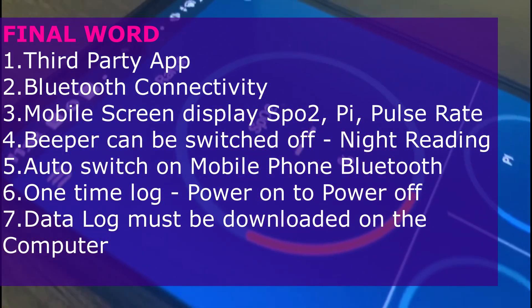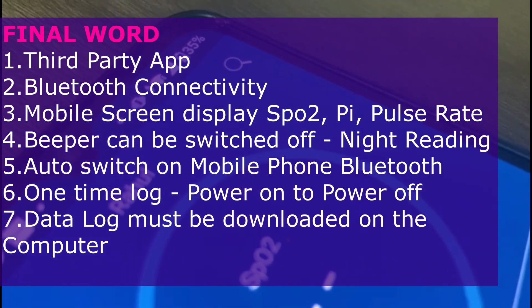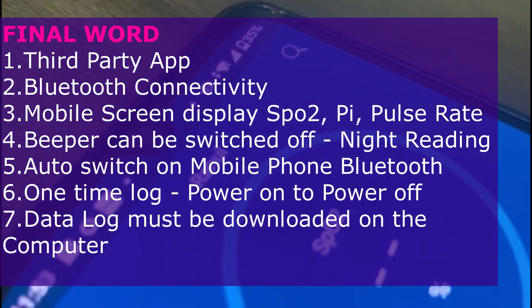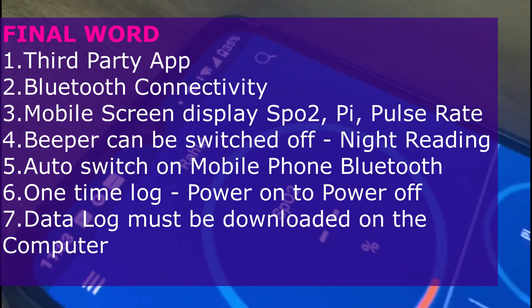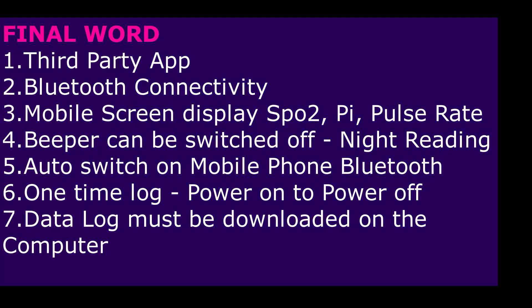The log is a one-time reading log which can be transferred. The oximeters do not come with a memory card, so it can only record from switch-on to switch-off. If you want to keep multiple logs, you have to consistently keep downloading the logs.